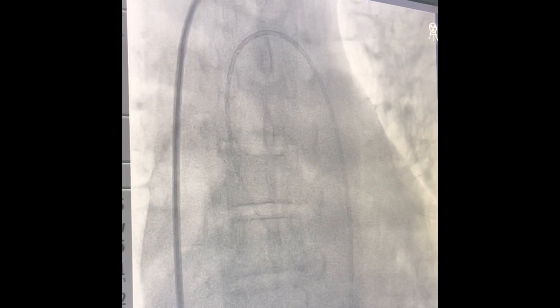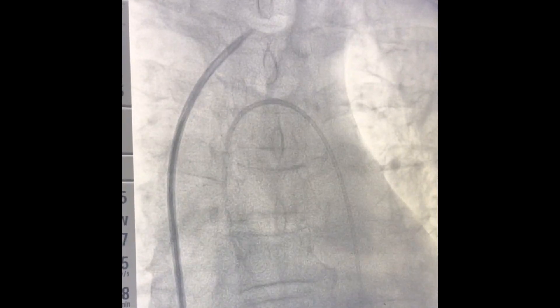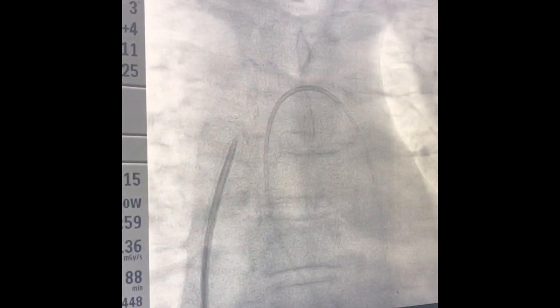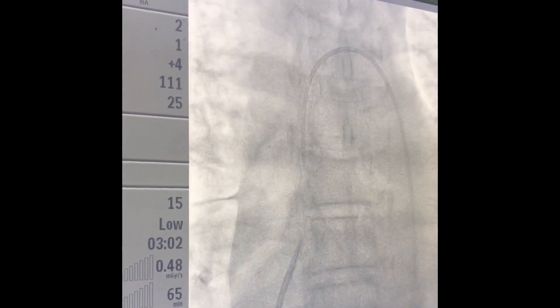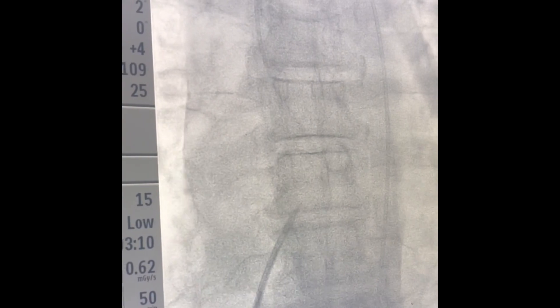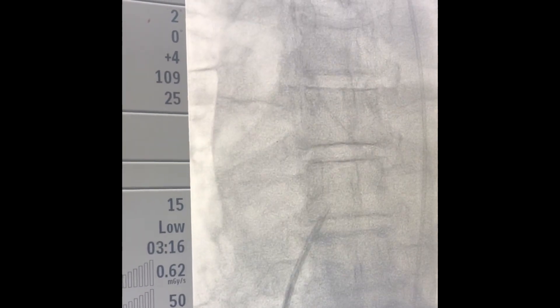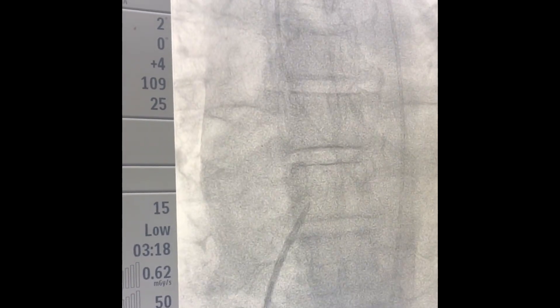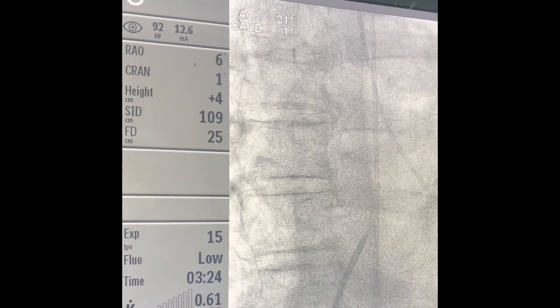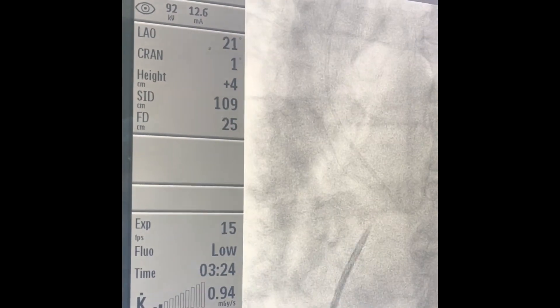You have to puncture two to three centimeters below that lowest aortic marker. In the AP projection, the vertical distance of the puncture should be two to three centimeters below the lowest point of the aorta. You can then go to RAO — the catheter should point just opposite to you. With all three landmarks, we ensure we are in the right position.